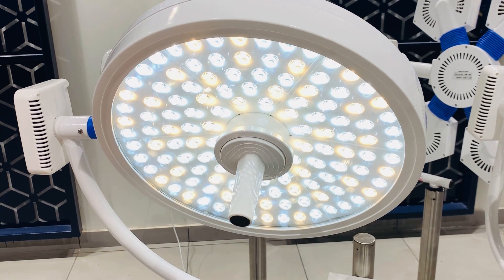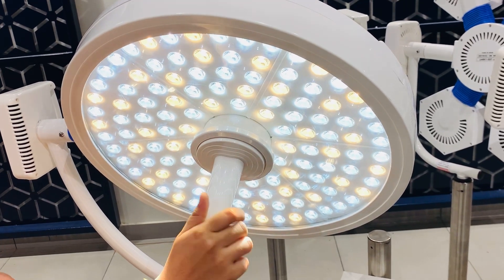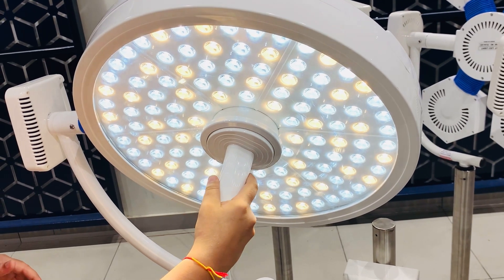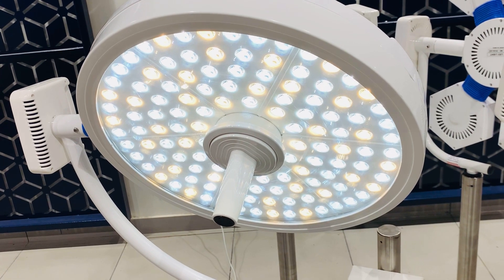These LEDs are from Germany, from Osram. We have provided a high-quality sterilizable handle for adjusting the focus. The size field of the light is 12 to 30 cm.